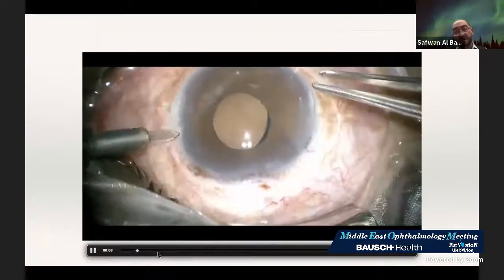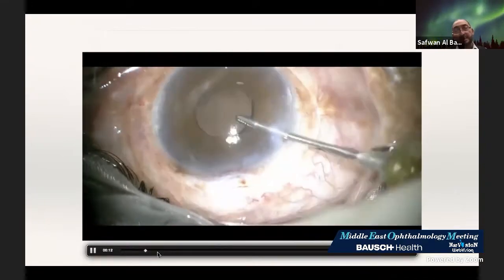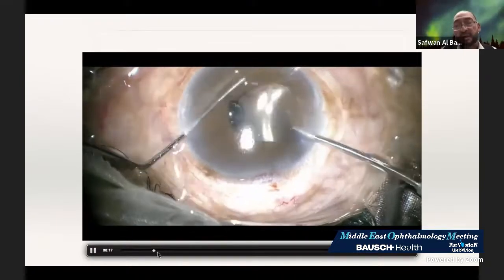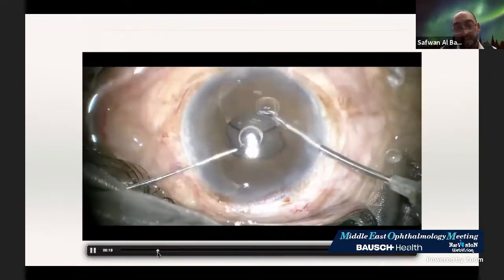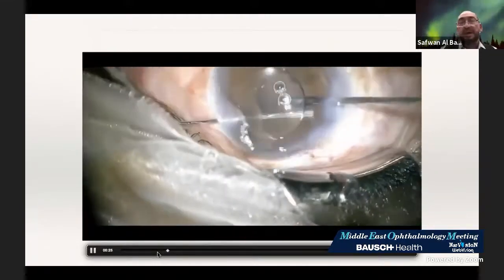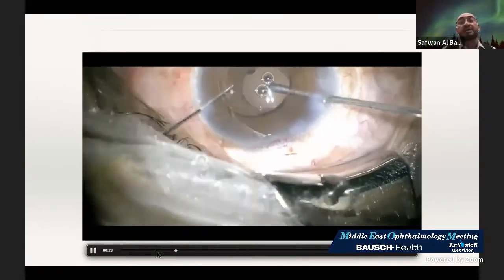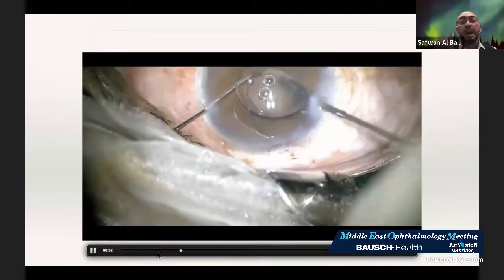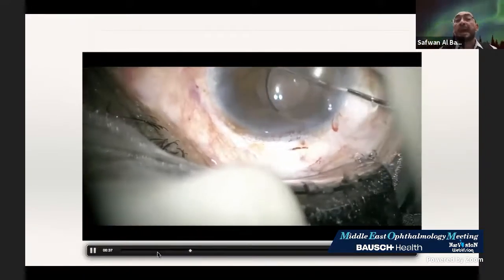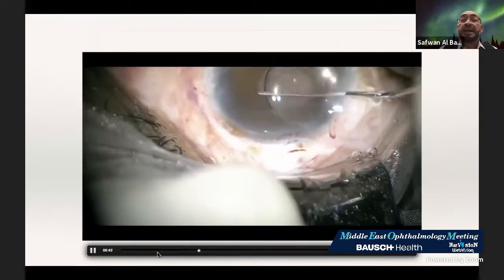Here I'm doing the paracentesis. The marker, the lens, I get it up, and it wasn't prepared for the record, so I'm just releasing the haptics from the bag, and then releasing the trailing haptics. I did my vitrectomy. The pupil is small here, so I was scared to touch the pupil, but in one step I used the retractor. But you can see, I returned to recentering the lens. The leading haptics was up.